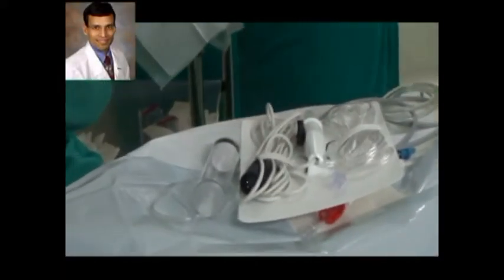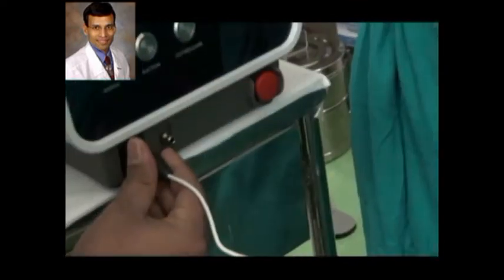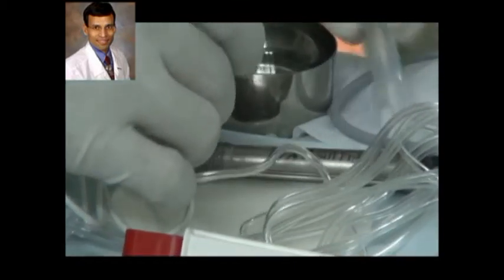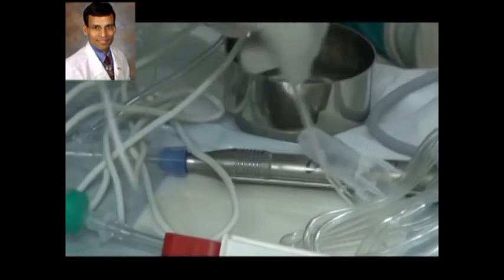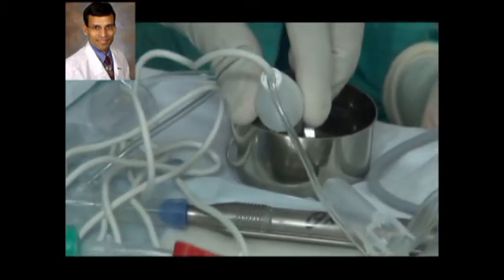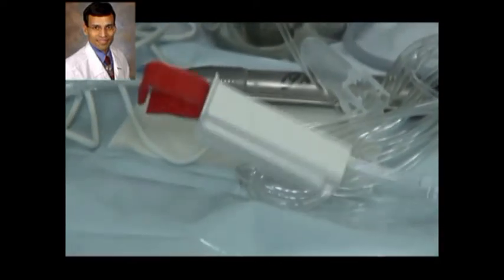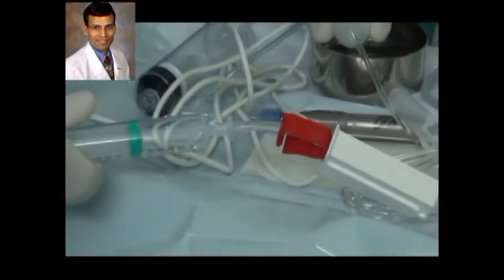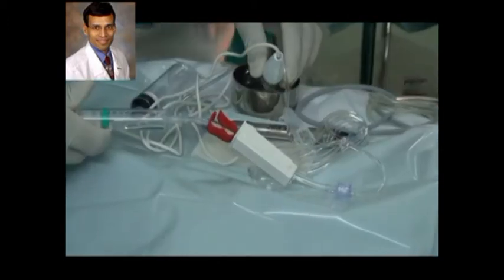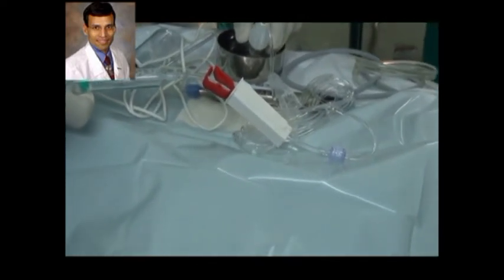As you can see here, the disposable handpiece has an electrical wire attached to the console and also has a tube coming out. Before we connect the handpiece to the machine, we dip the handpiece into a bowl of fluid and then use a syringe at the other end of the tube to suck out BSS into the entire tubing. Suction is applied until there is some fluid in the syringe and the BSS fills the entire tubing, leaving no air bubbles.